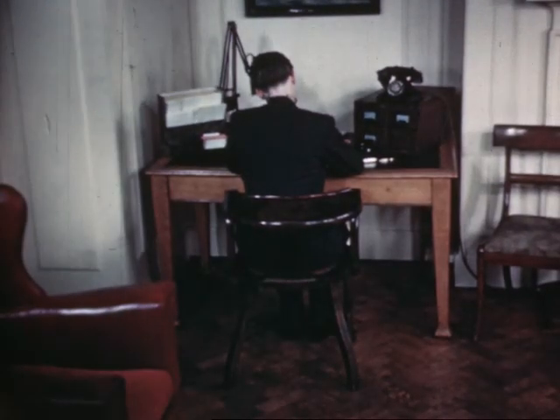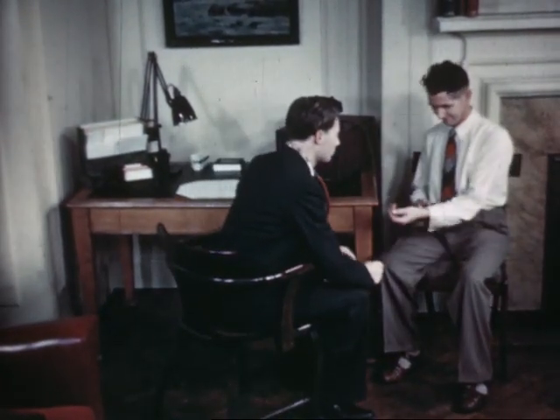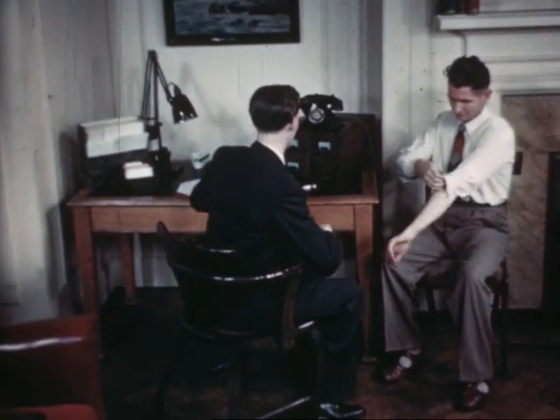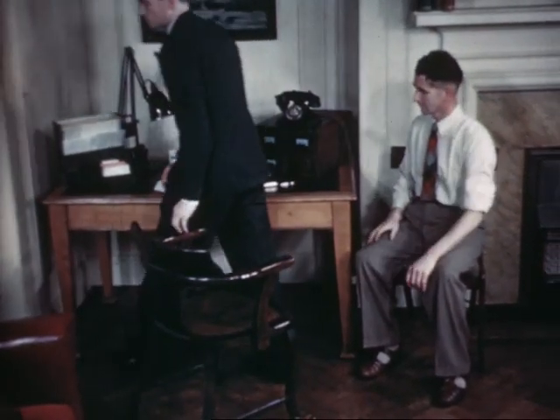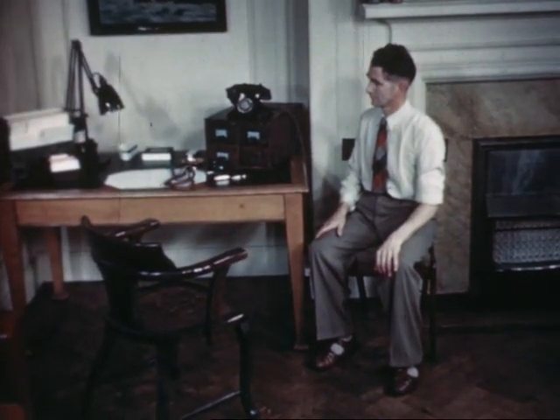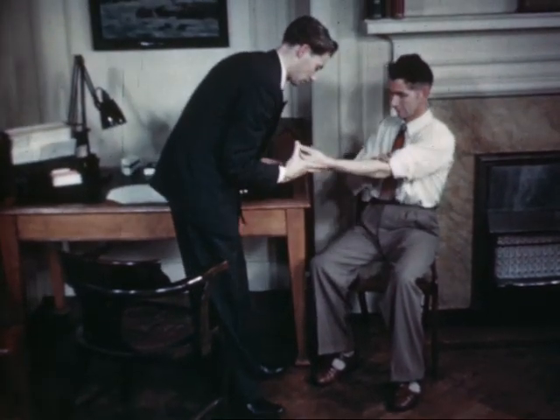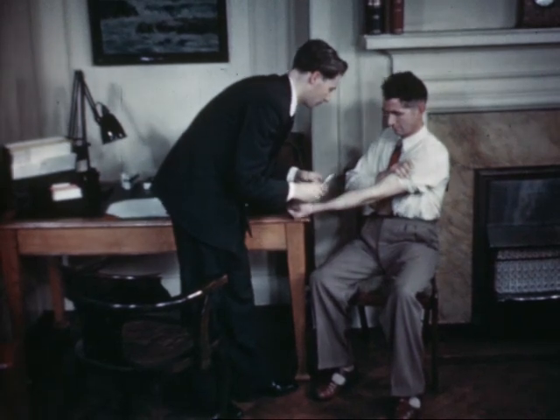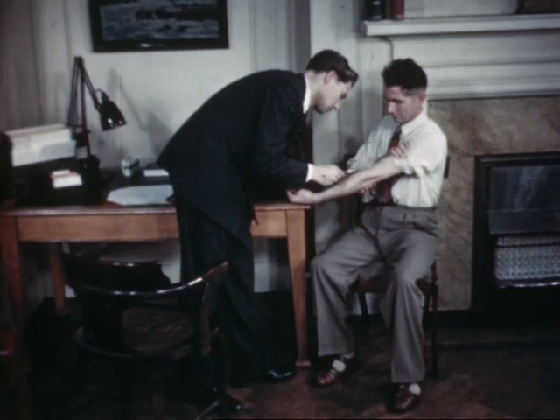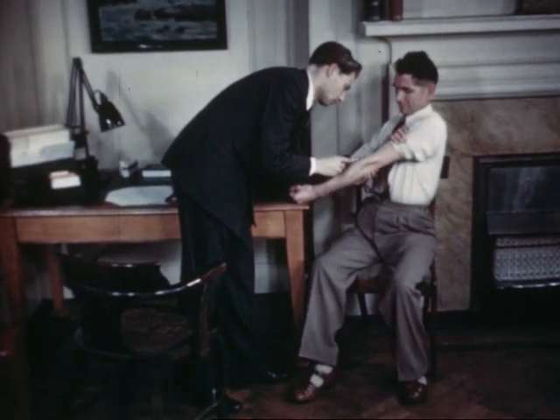However, it isn't always like this by any means. Here we have a patient who's had many venipunctures before and isn't in the least disturbed at the prospect of having another, although it is his first visit to this particular doctor. Let's see how he fares this time. He won't come back here in a hurry.